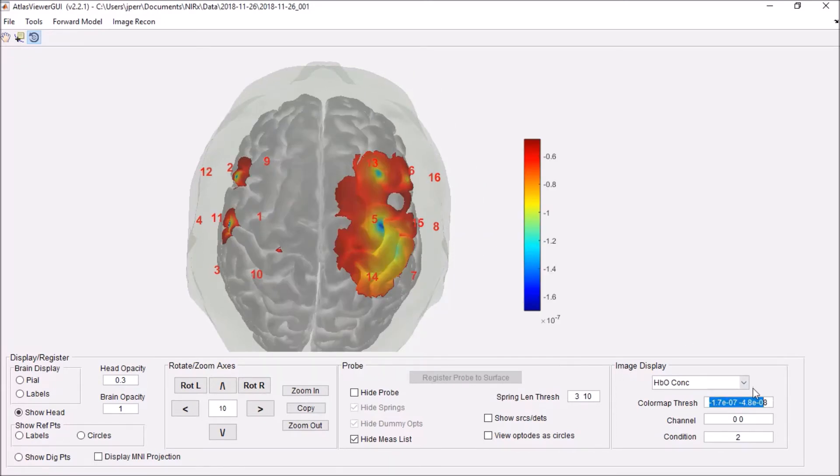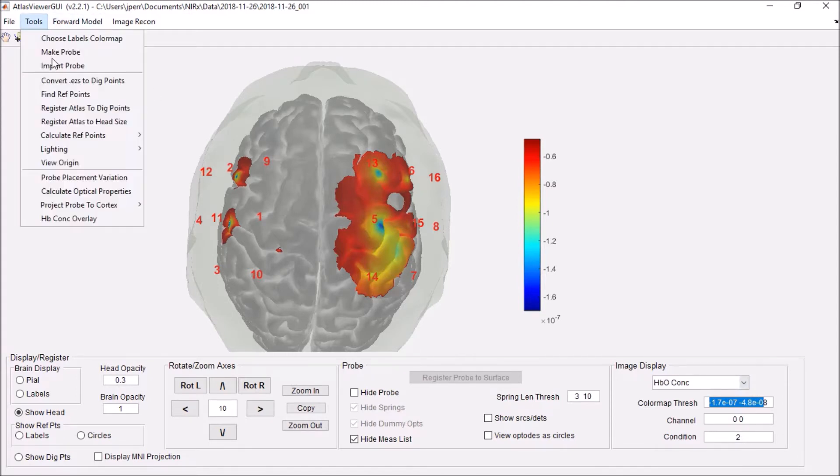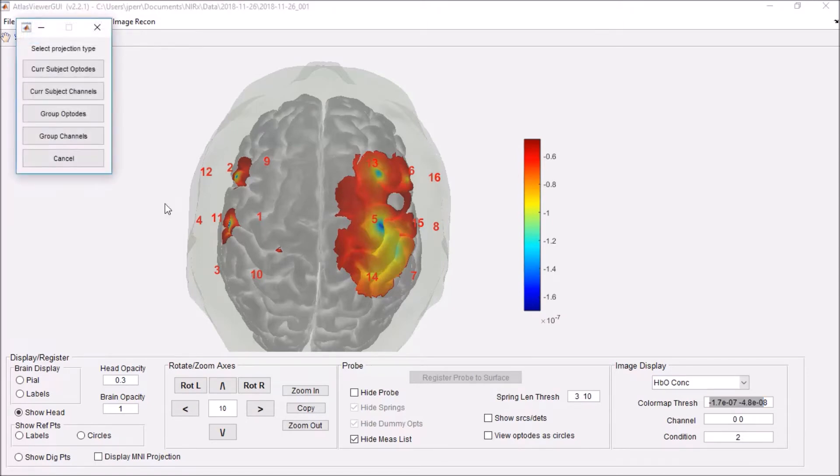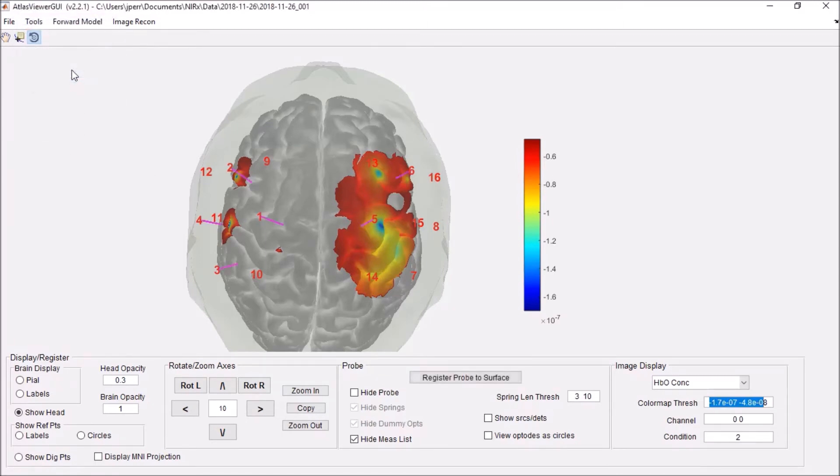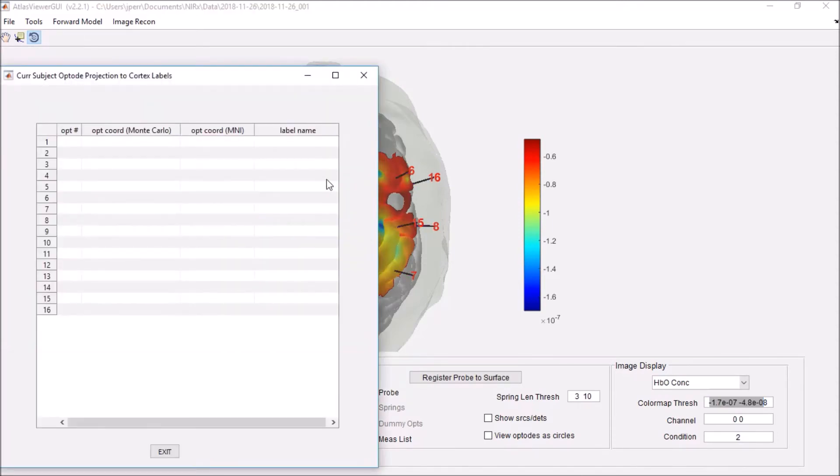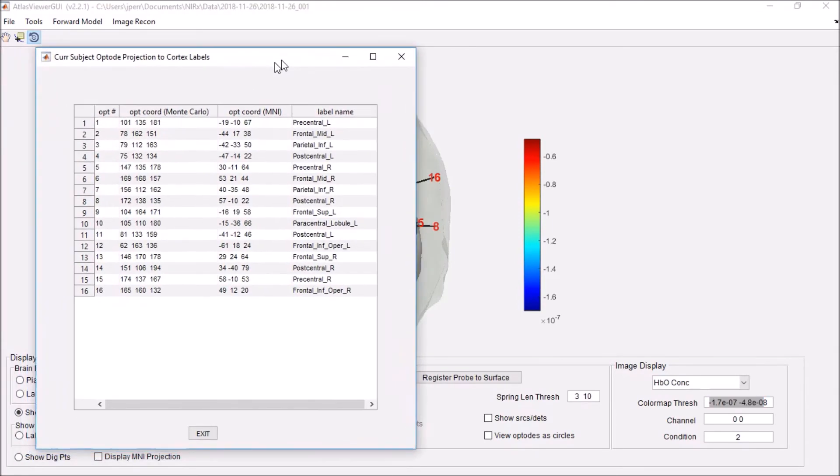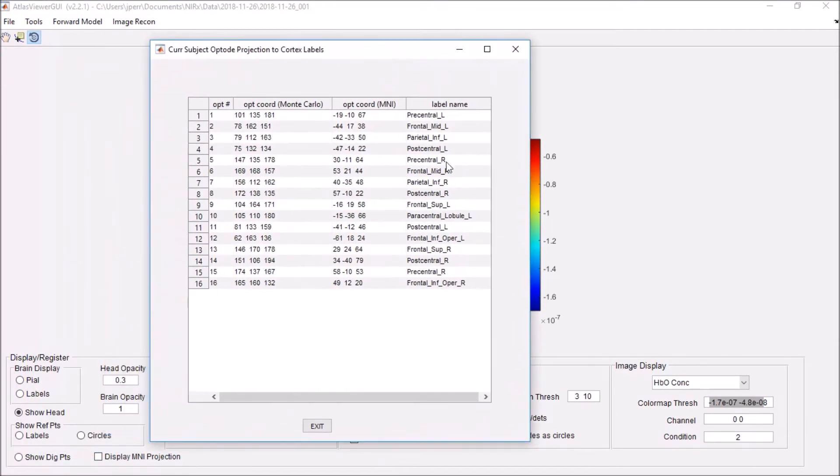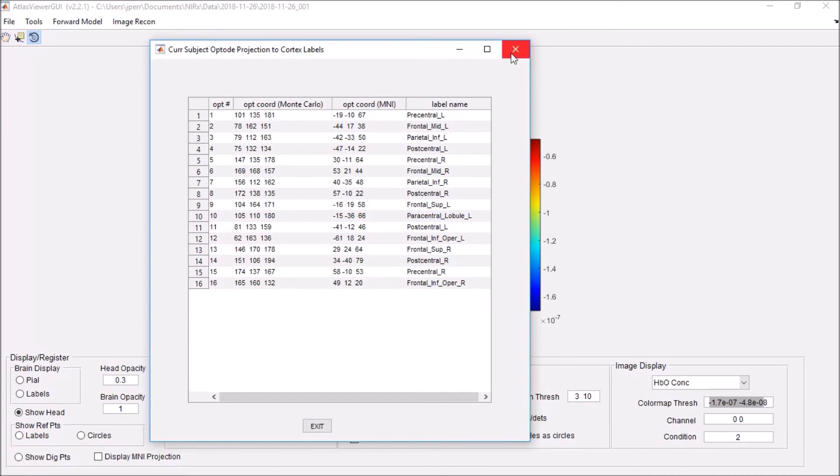You can also change the scale and do several other things. One other cool aspect is you can actually project the probe to the cortex. Once I do that, I'll click subject optodes. I'll actually pull these into what it assumes to be the proper places on the brain and give you the coordinates in the MNI space as well as the label. That may be pretty useful for a number of reasons.